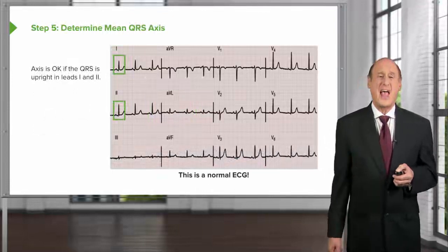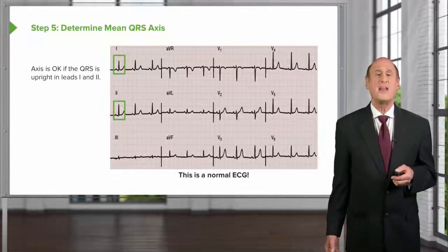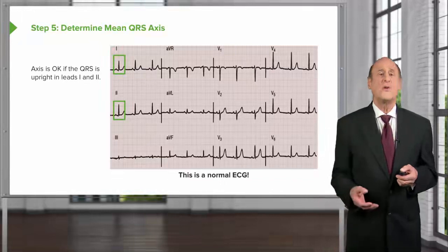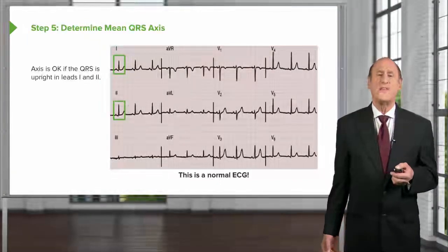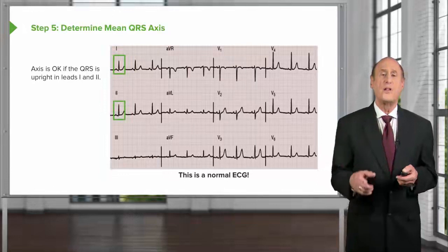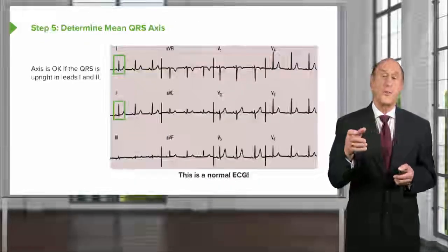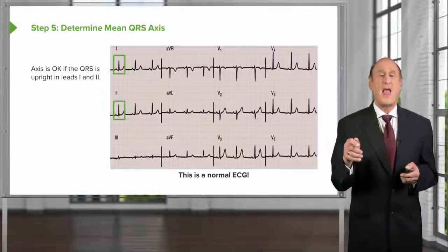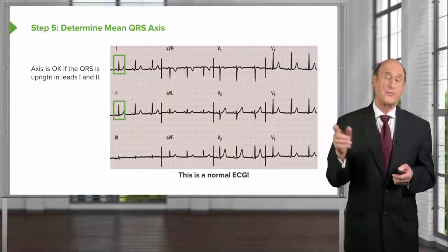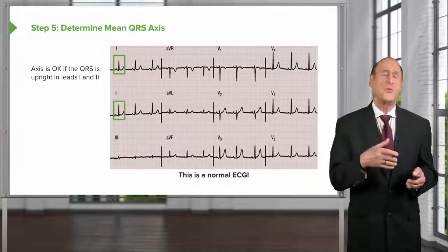Again, what about the axis? Well, there's a general rule that most med students use, and that is, if the QRS is upright in leads 1 and 2, it's a normal axis. You can actually calculate the axis because the axis is perpendicular to any lead where the R and the S, or the upstroke and the downstroke, are equal. In this example, lead 3. You see that pretty much the amount above the line and below the line is about the same. So the axis is going to be 90 degrees from lead 3. So 90 degrees plus 120, since lead 3 is 120, that's 210. That would be toward AVR, or minus 90 from 120 would be 30. That would be somewhere near lead 2, which is plus 60.